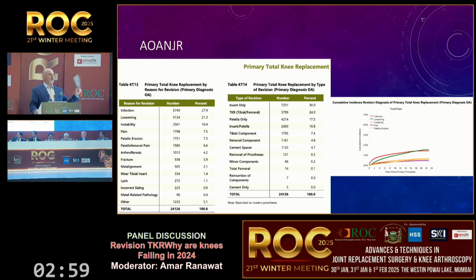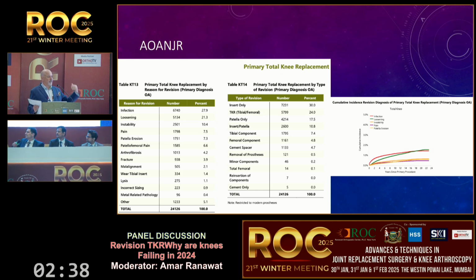Because you even mentioned fracture and trauma, and you're kind of blaming the patient. But if you're doing a hip and they get a periprosthetic fracture, is that a patient problem? Did they trip and fall, or is that a surgical problem? If there is something like a notching of the anterior cortex, then it's a surgeon problem. Let's go back to the knee. There's notching in the cortex. There are pinholes from your amazing robot that never screws up, right? Quadriceps repair, that happens only in robotics. Otherwise, it is the surgeon's problem, to the extent that you should spend more time counseling them.